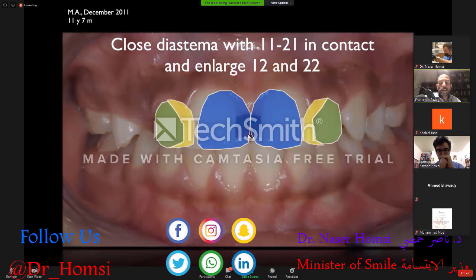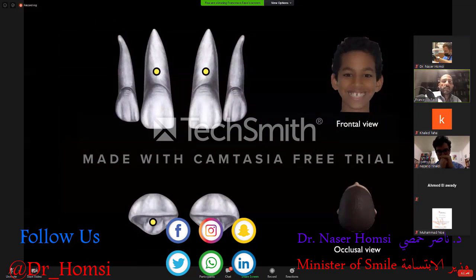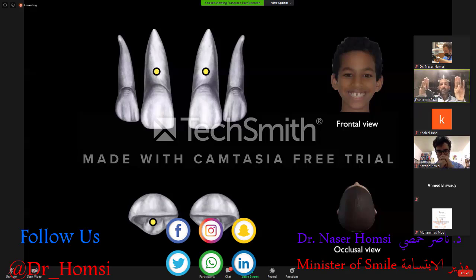So we go to the biomechanics and we decided to create a very easy, very basic appliance designed by the biomechanics principles. Let's think together about where the forces are needed to close the diastema, the gap between the upper central incisors, in a bodily way. We know from the biomechanics that the force required passes through the center of resistance in a frontal view.